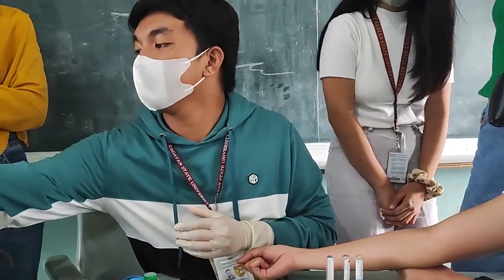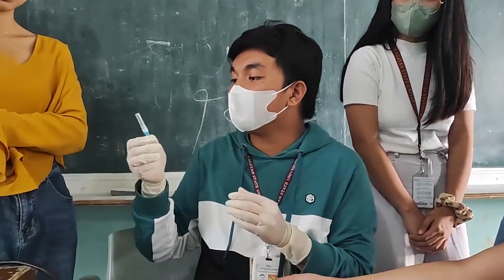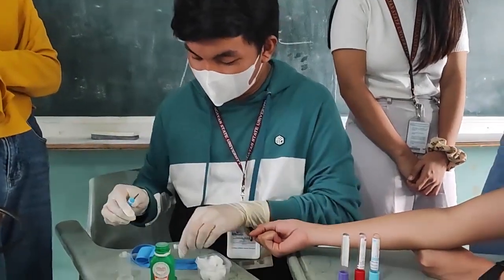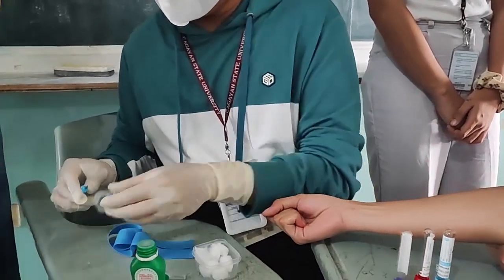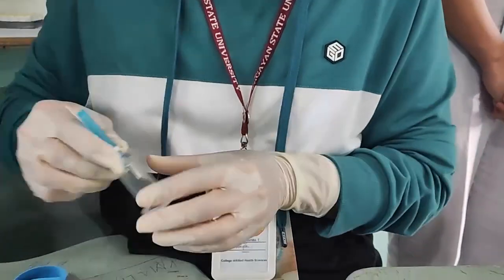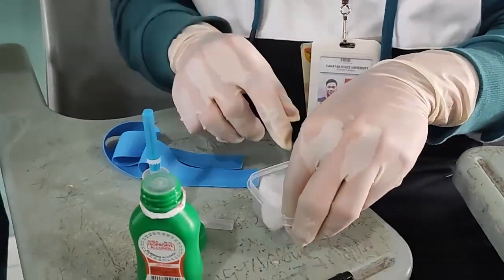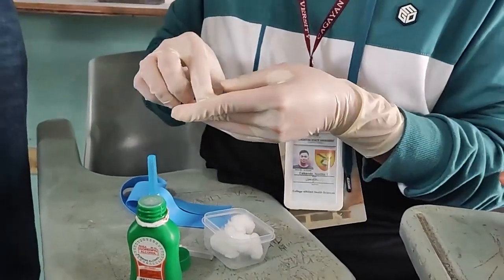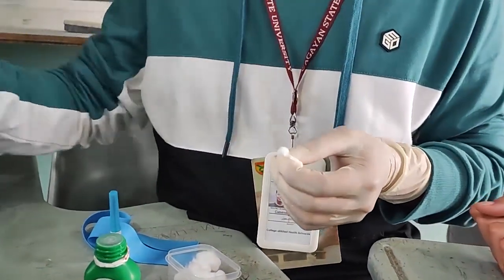Now, i-prepare ko po yung gamit. So, we have here po yung ating multi-sample needle. And then, i-prepare din po natin itong cotton na after ng venipuncture.